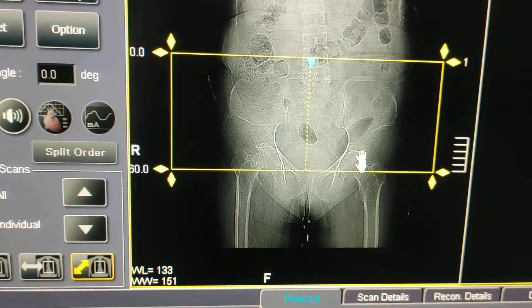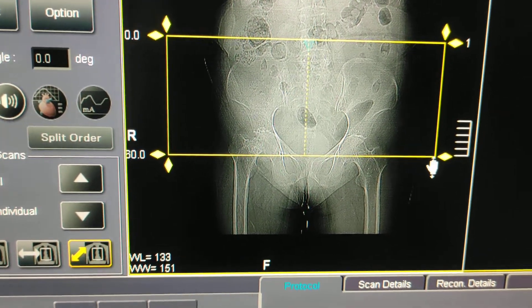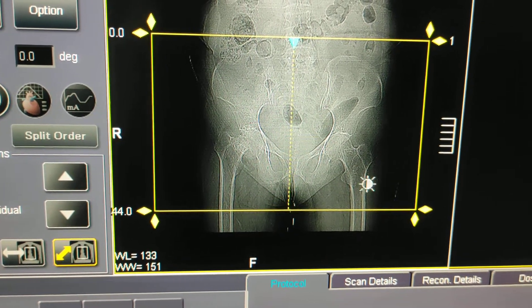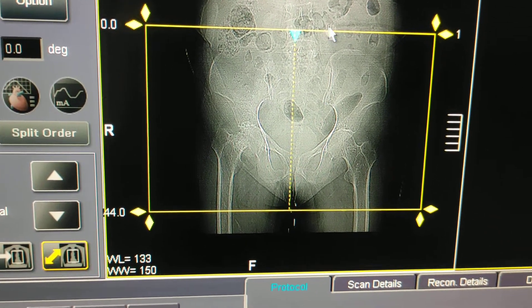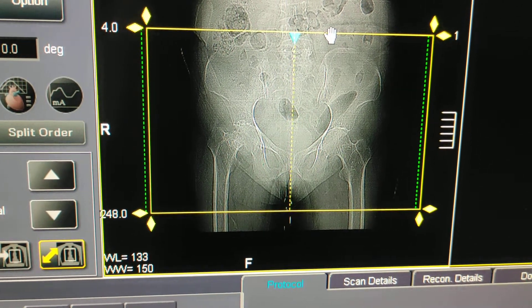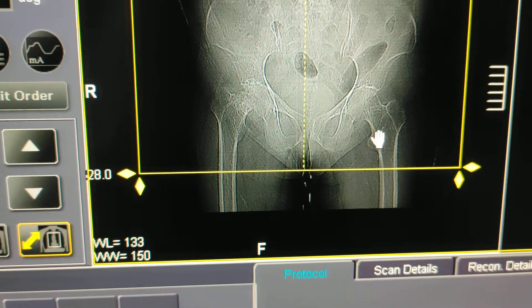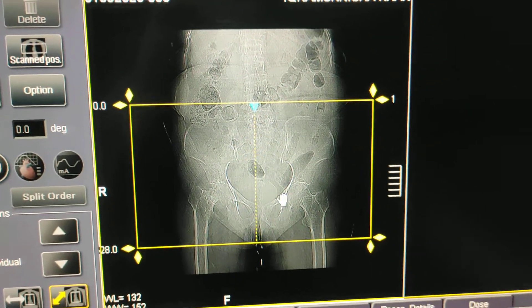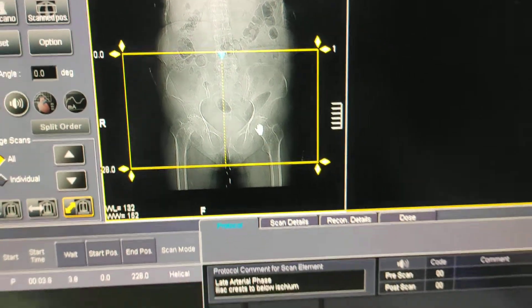You have to start slightly above the iliac crest, because when we are making 3D images, if you take a cut-to-cut scan the 3D will not come out properly. So you have to start from above the iliac bone slightly upwards and cover down to the lesser trochanter. This is the complete plan for pelvis with both hip joints.